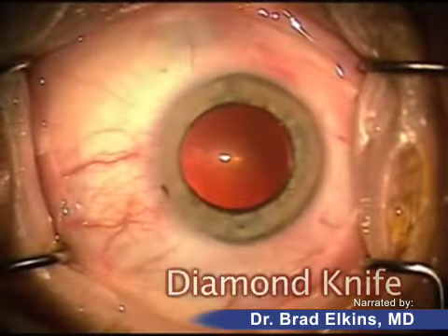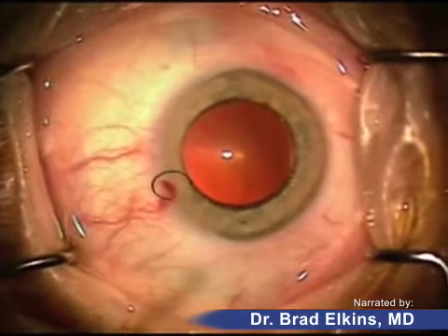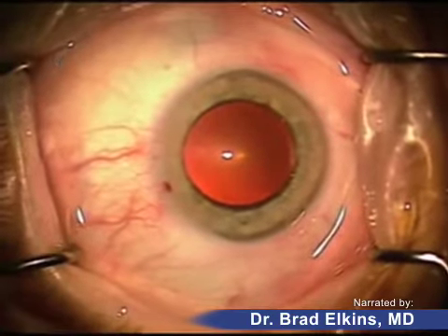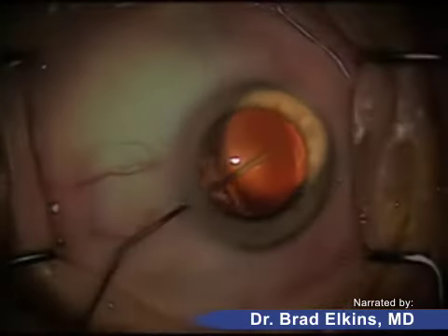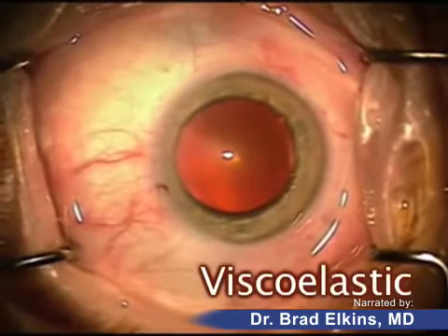That's a diamond knife that just made a small incision into the eye. A little bit of fluid is injected — this is a topical anesthetic which goes inside the eye to help numb it further. This is a jelly called a viscoelastic being injected in the eye, which maintains the shape of the eye.